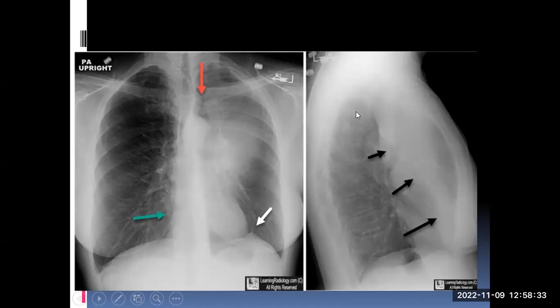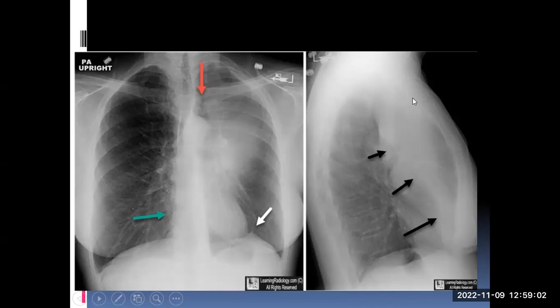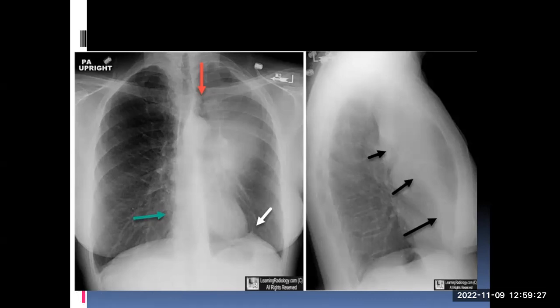Let me explain the Luftsichel sign. In left upper lobe collapse, looking at the lateral film, the oblique fissure is drawn upward anteriorly because at the hilum it is fixed — so the fissure is pulled up at the top and anteriorly at the bottom. The lower lobe, attached to the posterior aspect of the fissure, is also pulled up and becomes hyperinflated. When you look at it from the front, this upper area appears more lucent than the lower area, giving inhomogeneous veil-like opacity. The crescent of lucency surrounding the aortic knuckle is made up by this expanded lower lobe. I would like you to register this well, as these findings might save the day for you in peripheral practice.